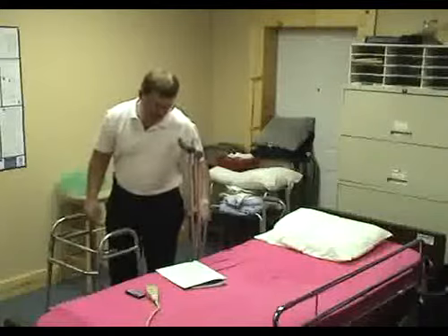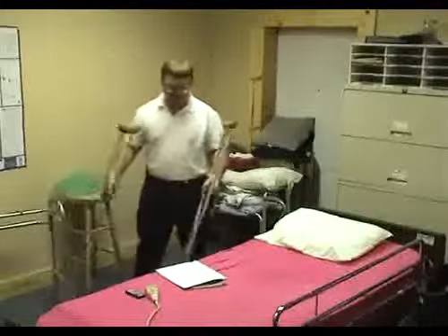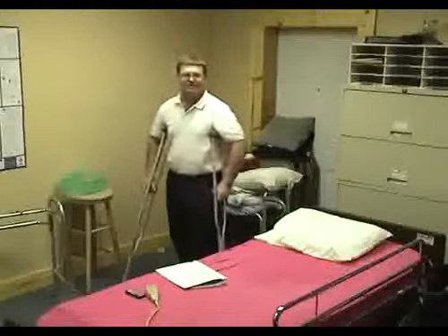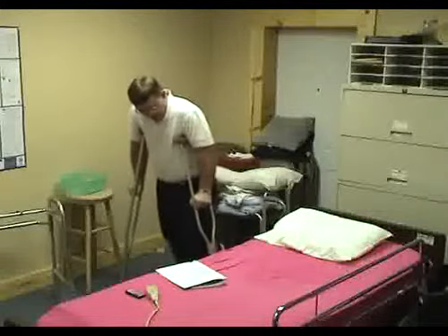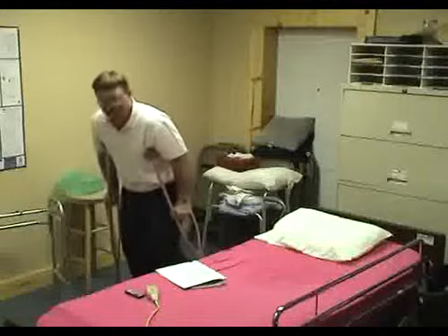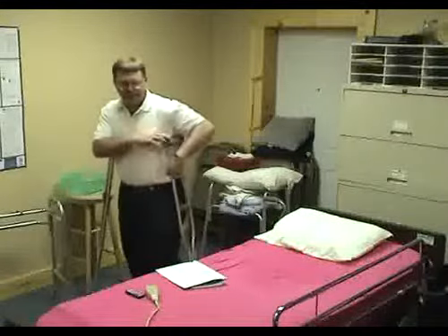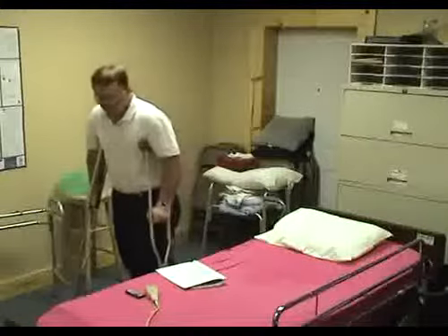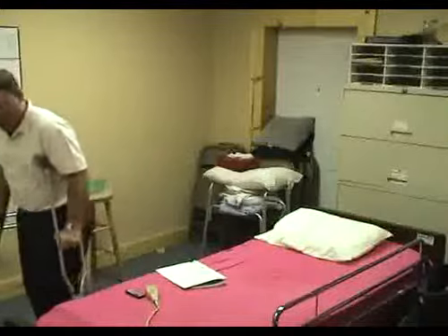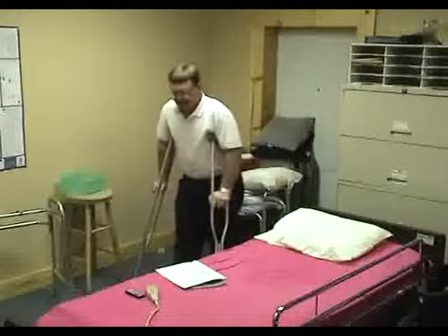And C, encourage the client to bear weight on their hands and not the axilla when using crutches. So we'll start with the crutches. Okay, my left leg is bad, so I'm holding it up in the air. And when I walk, all of my weight should be on my hands. There shouldn't be any pressure at all. There should actually be about an inch between underneath my armpit, that's called the axilla, and the top of the crutch. It shouldn't hit there at all. So if you ever have a patient that has crutches, you now know how to use them correctly.